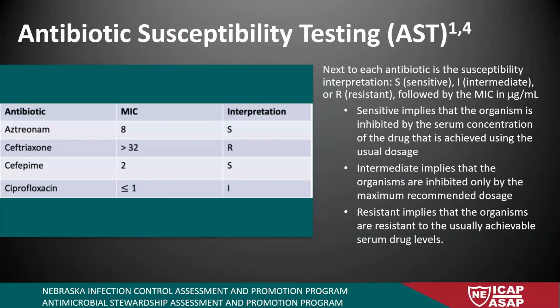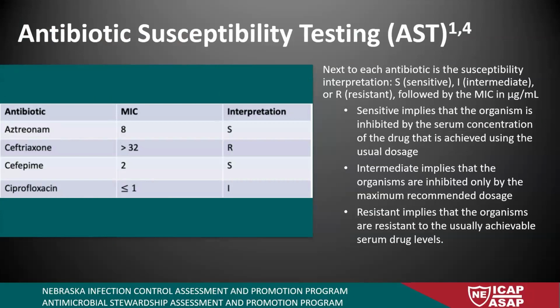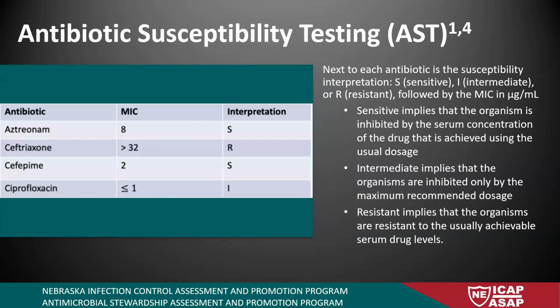So here is some sputum culture results. They look totally different depending on what your lab looks like and how they send it. There's totally different examples. This one's really little. Sorry, guys, that's hard to see. But this one just has a line about what the microorganism was, that it was positive for KPC carbapenemase. It's clinically resistant to all beta lactams, and you should ask somebody for help.